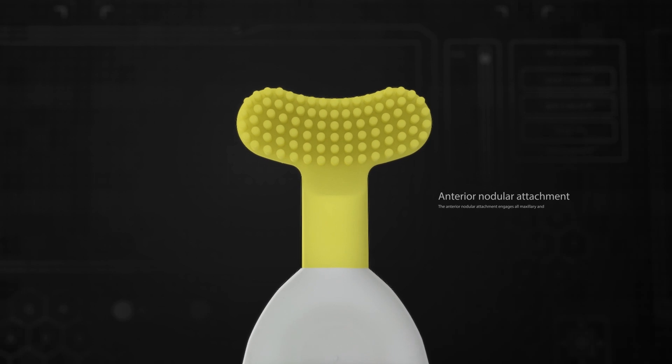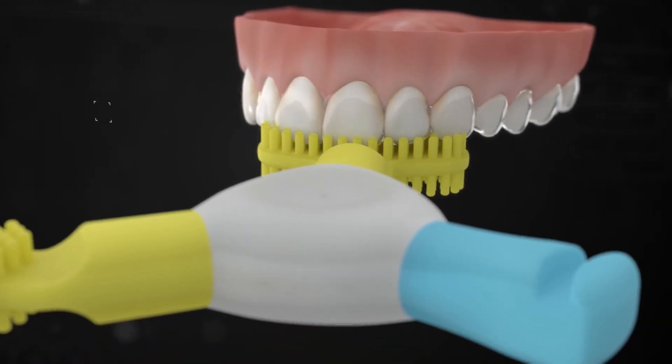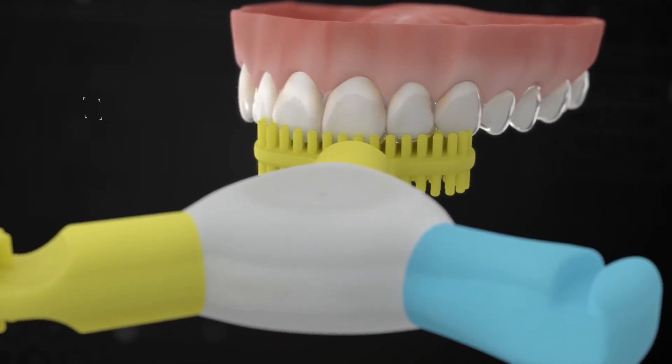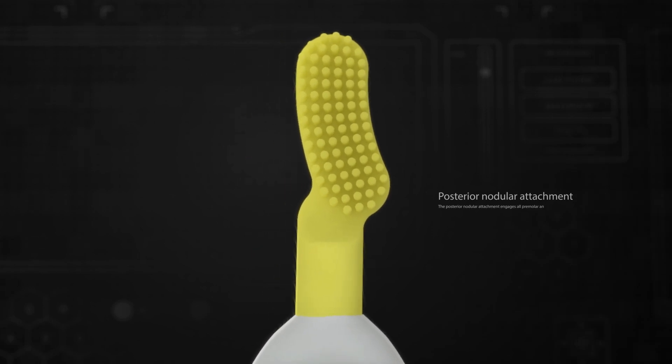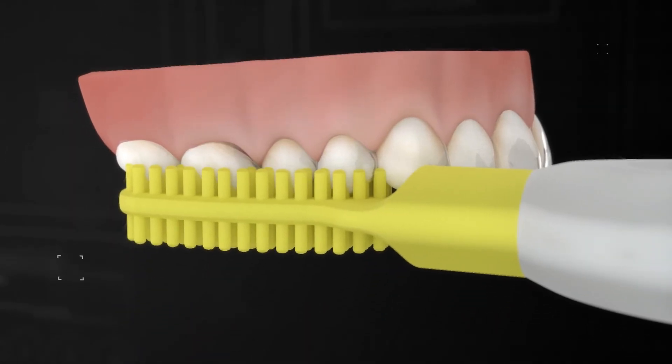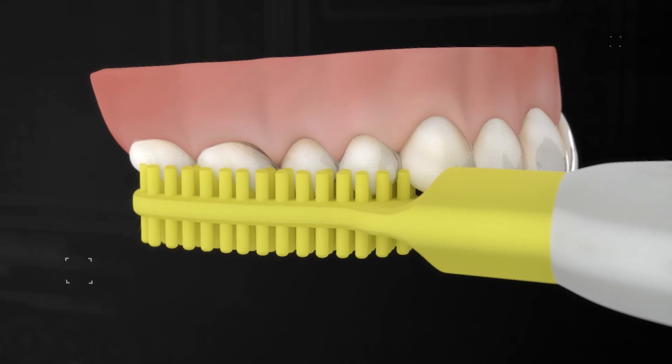The anterior nodular attachment engages all maxillary and mandibular anterior teeth. The posterior nodular attachment engages all premolar and molar teeth regardless of the occlusal plane.